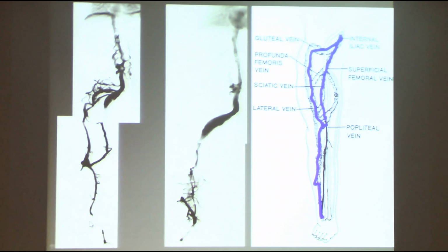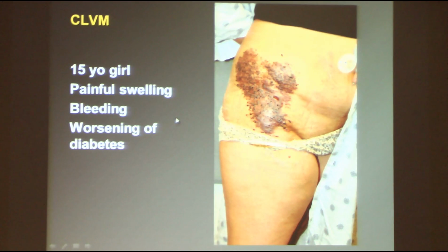Another patient, a very young one, marginal vein, tons of veins in the buttock, and a big sciatic vein here. And when we close the superficial vein, we see the deep veins are present, but they're really small thread-like channels. Other locations can have similar anomalies.